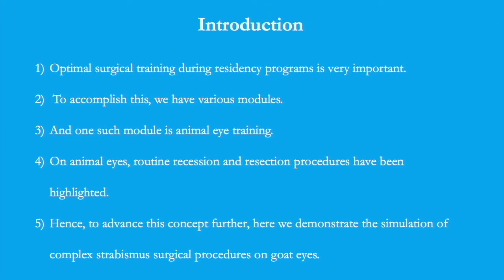This is a video demonstrating complex strabismus surgery simulated. The authors have no financial interest.